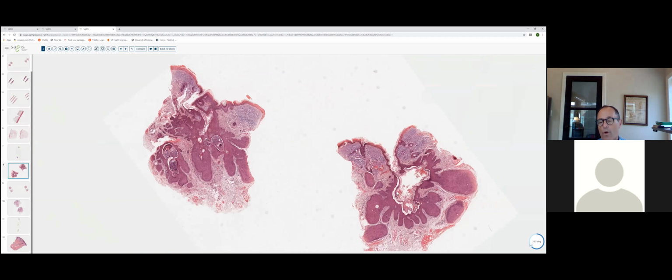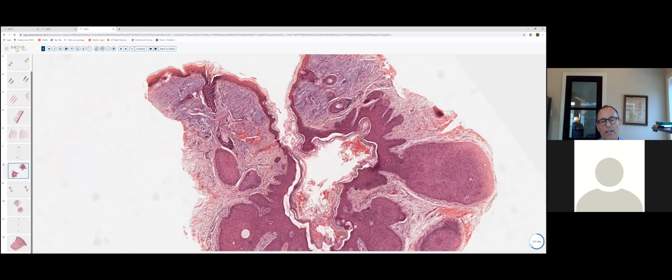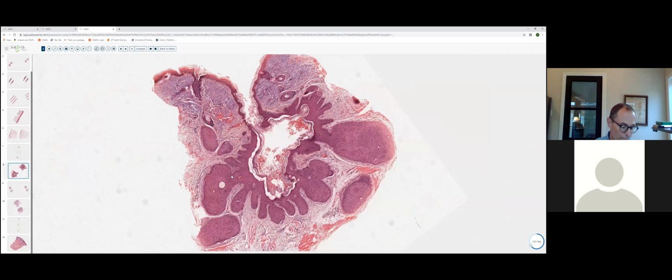And again, we have this cystic invagination of the epidermis, looks like a kind of a widely dilated follicular infundibulum, showing infundibular type keratinization with a granular layer and basket weave orthokeratosis. And once again, radiating from the wall of this structure, we have these epithelial projections.